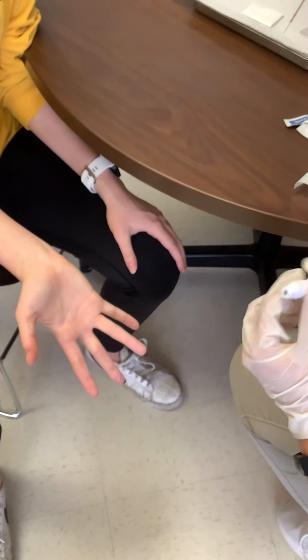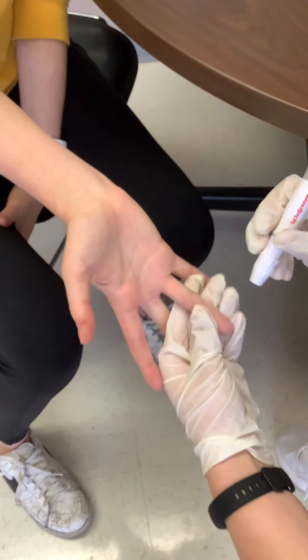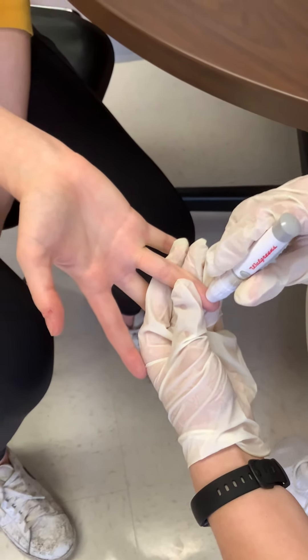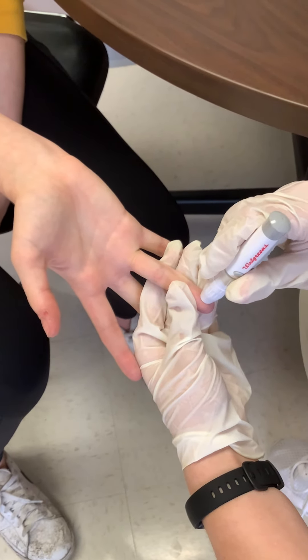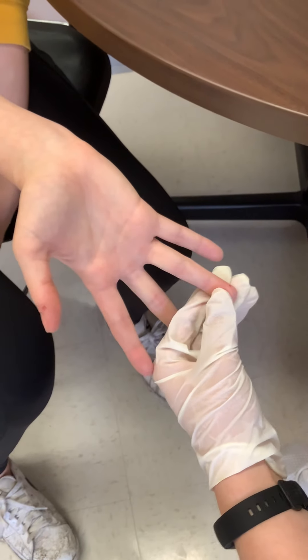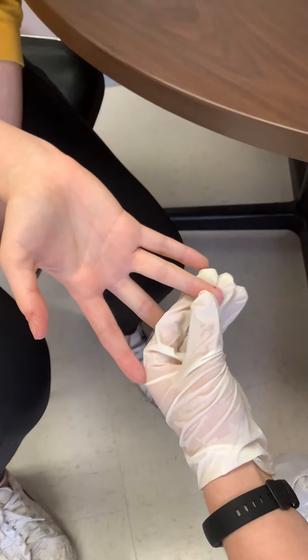Now that I know it's ready, I'm going to grab the participant's finger and ask: are you ready? I like to go just in a little bit towards the side. Don't be afraid to apply a little bit of pressure before you hit that button. Then hit that button and you should be good. Squeeze a little bit and wipe away that first drop of blood.